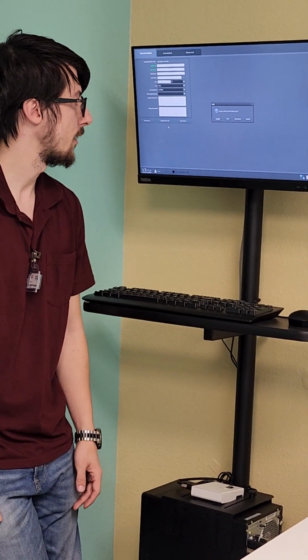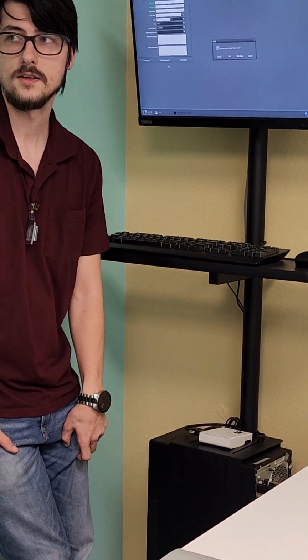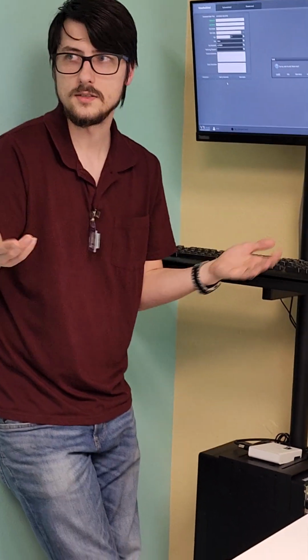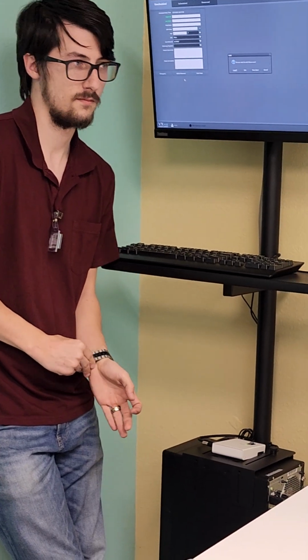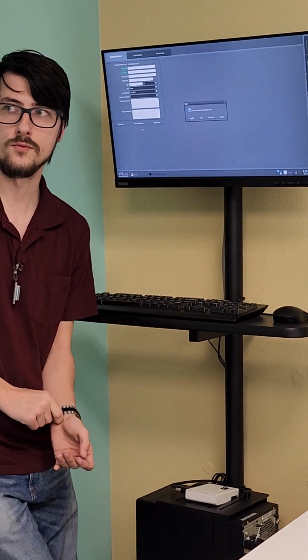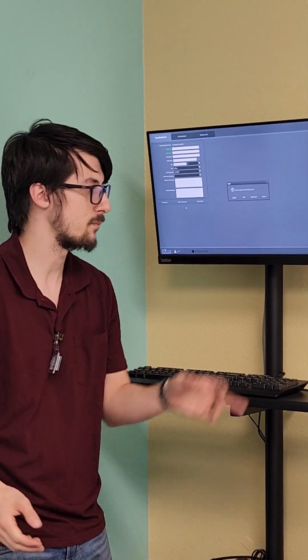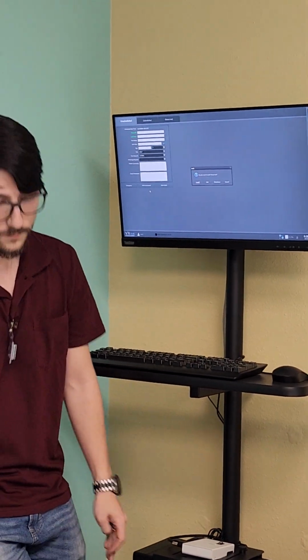Do you recommend shutting the system down every night? Yes. It's like you would go to sleep every night. It kind of clears your brain. This clears the RAM. It helps it stay fast. I've had people not shut down their system for weeks, months, and it just drags because the RAM is so full. It's trying to remember everything, but it can't. So yeah, shut it down at the end of the day. It's pretty simple. Exit, shut down, everything turns off. You're good to go.